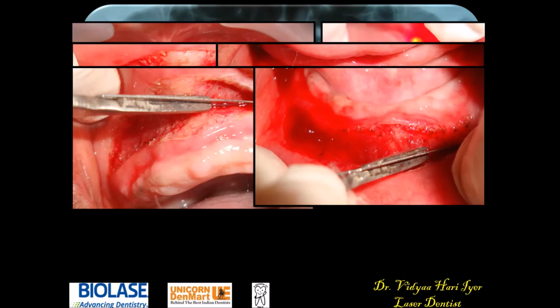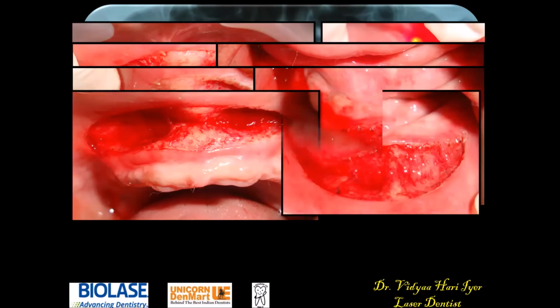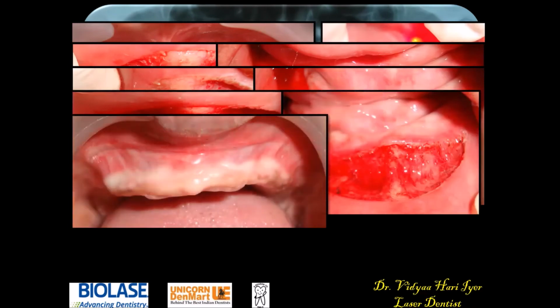Right. So now this is immediate post-op, and you can see that's an immediate post-op again of the lower, and this is how the patient heals. Now this is very, very important, my dear friends. Now why do I say this? Because till now I used only lasers in the oral cavity, but here I used a scalpel, and now I'm going to show you with a pointer. Can you see this white line there? This is called a scar formation.